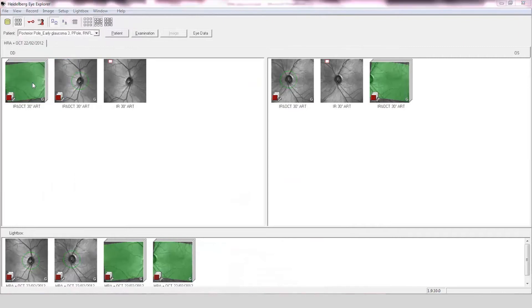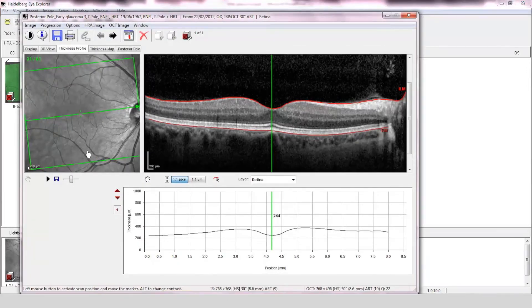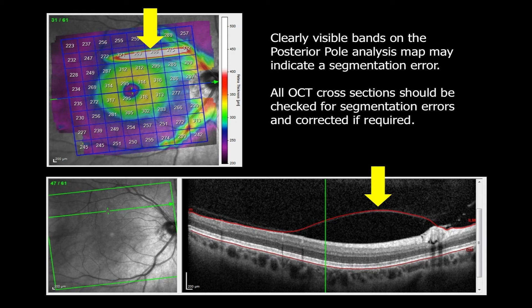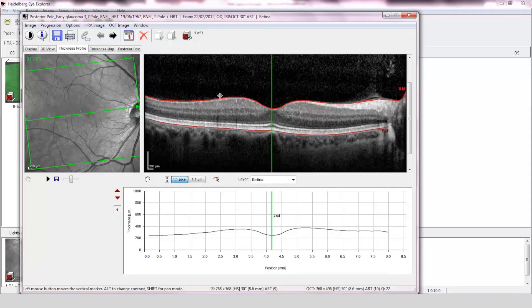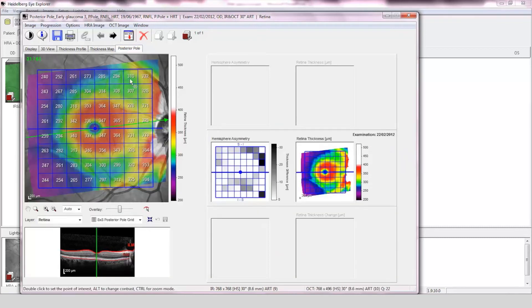Posterior pole assessment. The OCT scan is of good quality and the image has been accurately segmented. The posterior pole asymmetry assessment is normal with just one abnormal pixel element in the superior hemisphere.